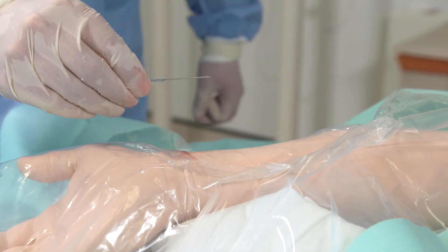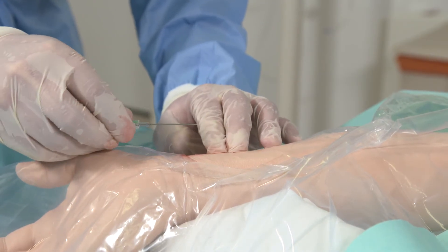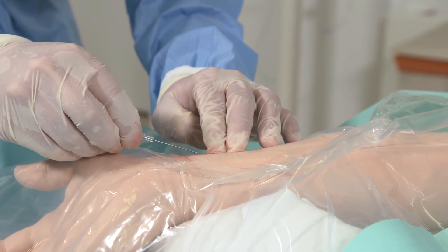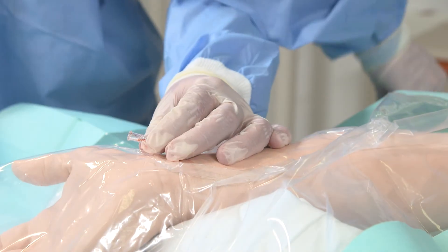We're now ready to insert the needle. Palpating the radial pulse, and similar to as you would in an arterial blood gas but at a more shallow angle, introduce the needle until you see blood spurting out of the artery.